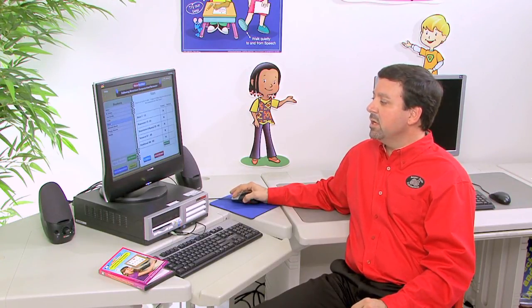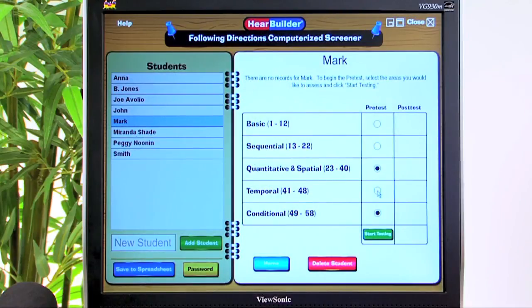Now we will go back to the home screen, and now let's look at some examples from the Quantitative and Spatial subtest.